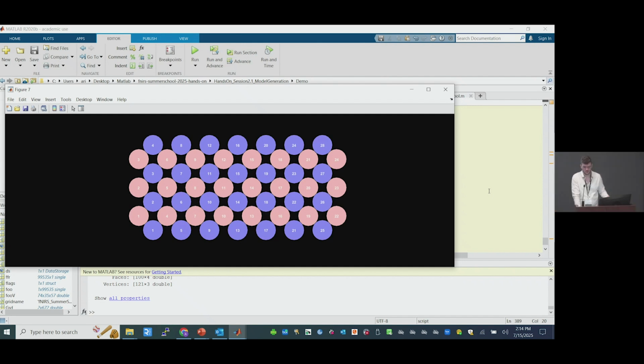And for those of you here who may have been a little bit confused what Joe meant by sync signal, that is how we synchronize our events for the stimulus with our actual data. There are multiple ways to do that. You could do it with a TTL pulse from a cable. You could do it with an audio boop that is played and recorded in the data. But there's multiple ways to synchronize your data with your stimulus.